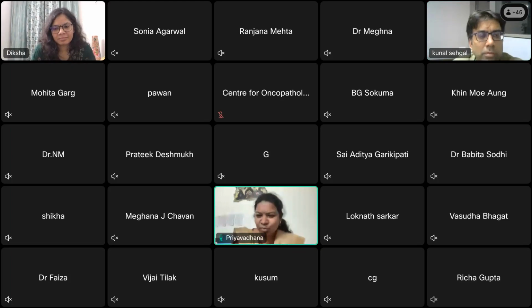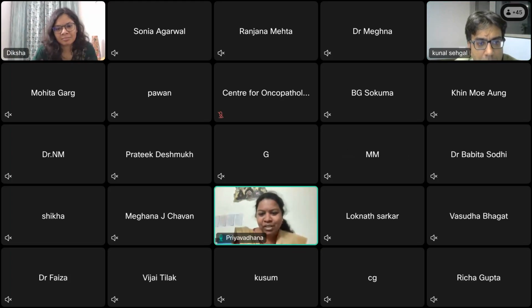Sir, there are no more questions, and thank you so much for your valuable comments. What I would like to add are a few suggestions to residents who are listening. Please make it a point to at least see the flags on whatever slides you're seeing. Residents just see the slides, report and finish off. Please try to go back and see. At least for bone marrow aspirates, get the counter values and see those flags.